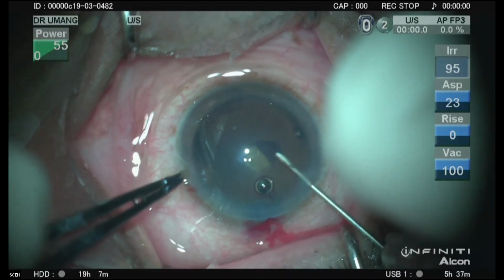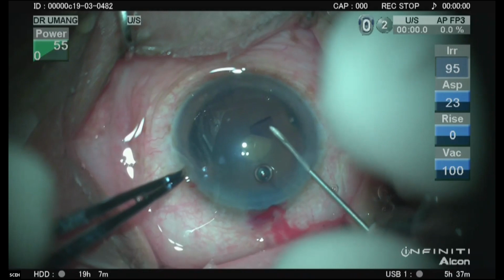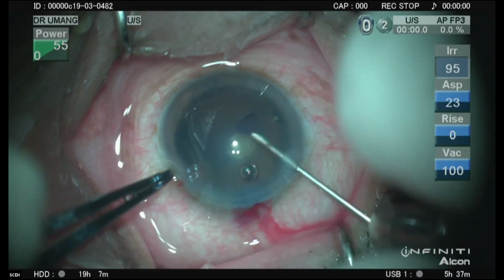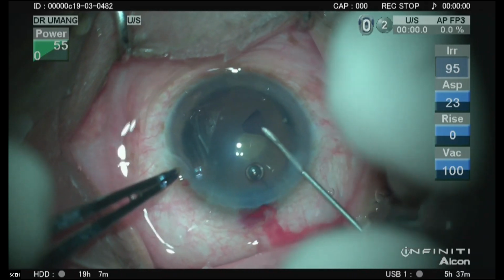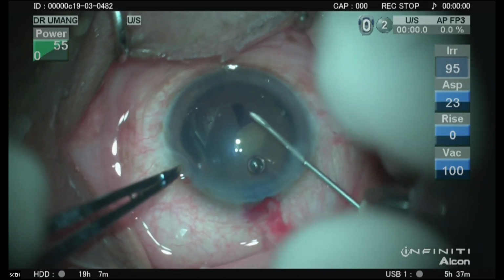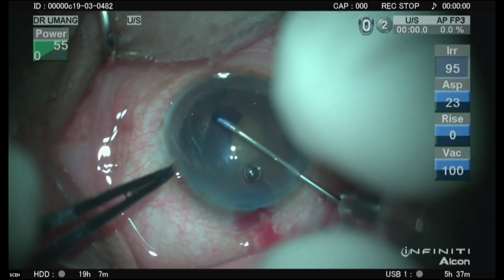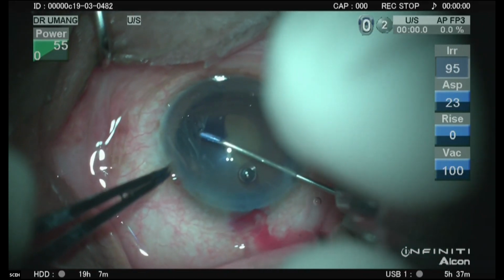Initiating the flap, and with the shearing motion, it is not directed towards the center. You're tangentially moving, with slow movements, staying about a clock hour away from the fold.